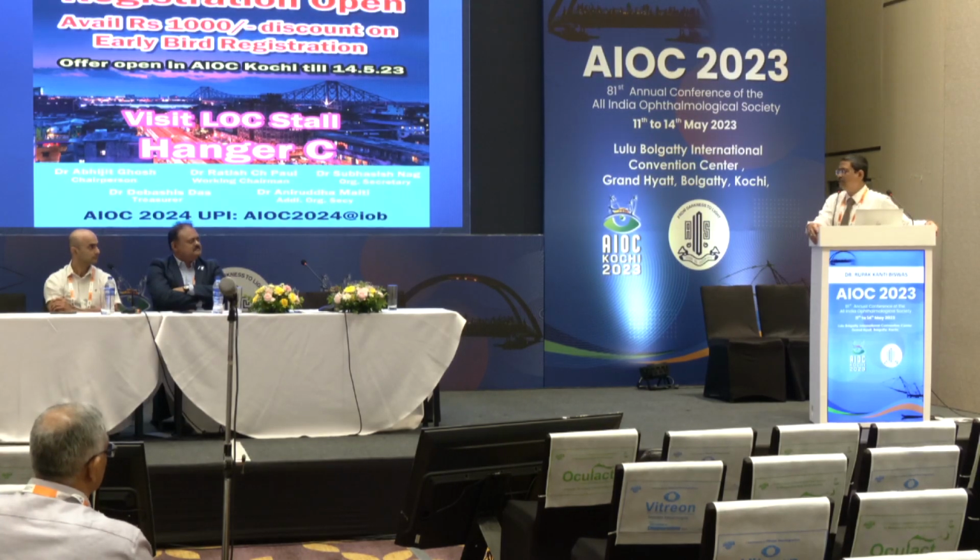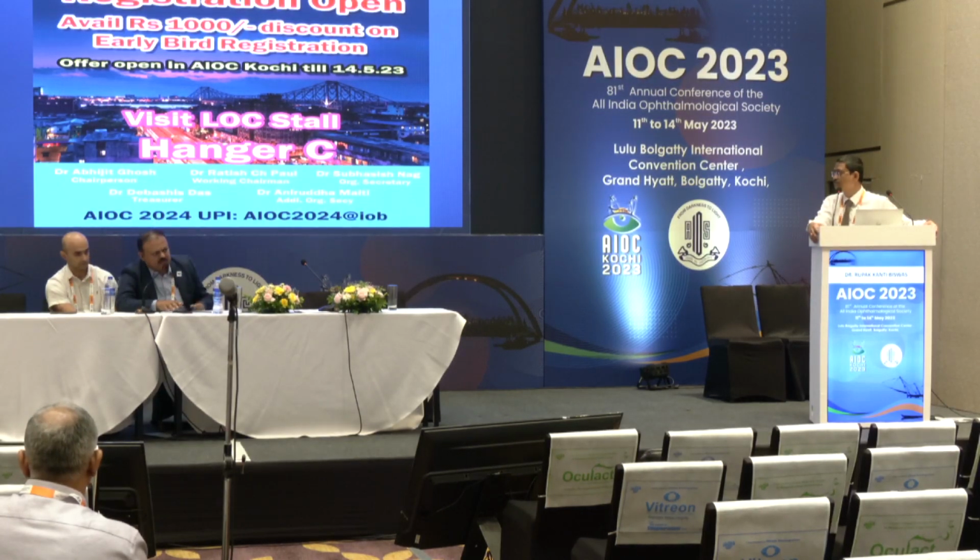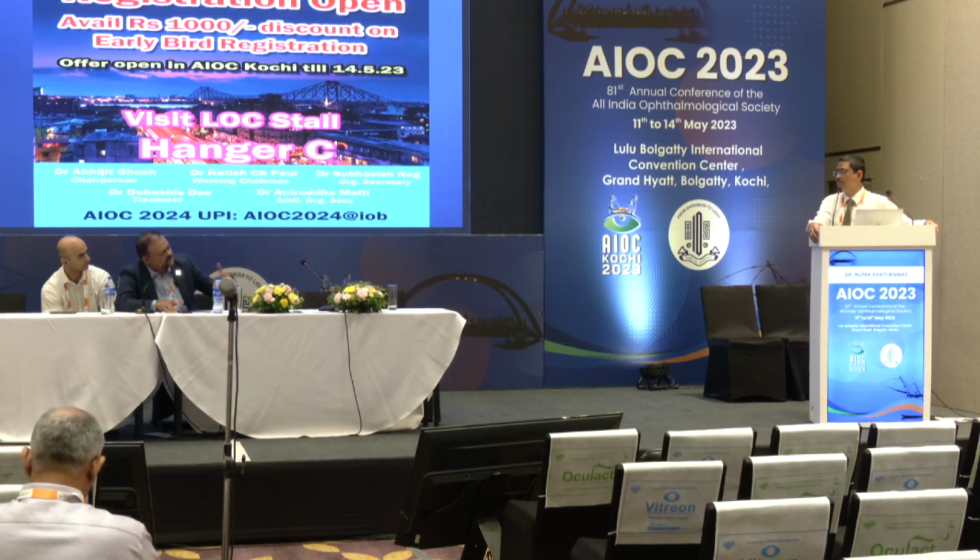But again, anti-VEGF, I don't think it has any role in this kind of situation, because that is a waste; anti-VEGF is not going to work for at least a month. So by doing vitrectomy it will get washed out. Maybe at the end you can put it, but under the silicone oil there is a matter of doubt. I think we give anti-VEGF when we are planning for intravitreal TPA, anti-VEGF injection as well as gas.